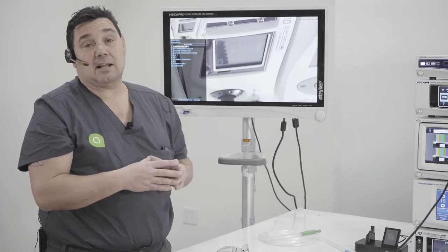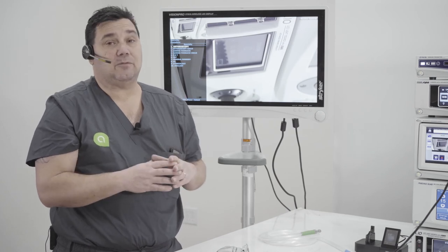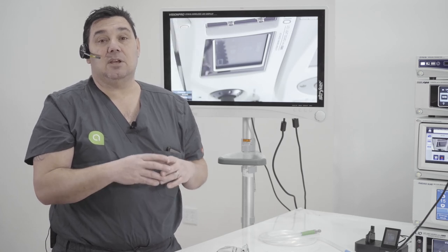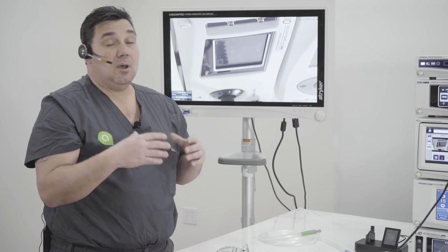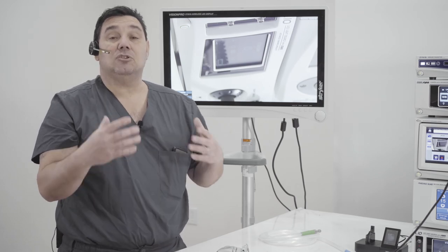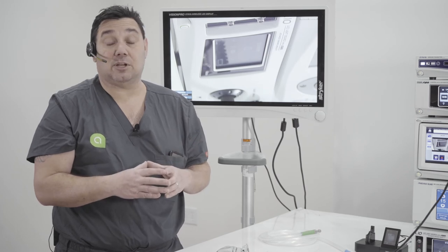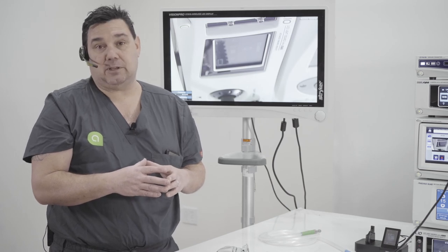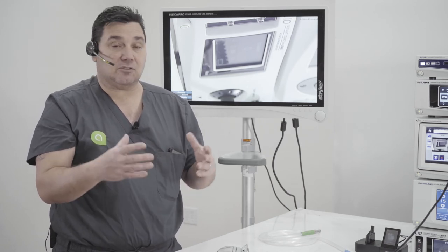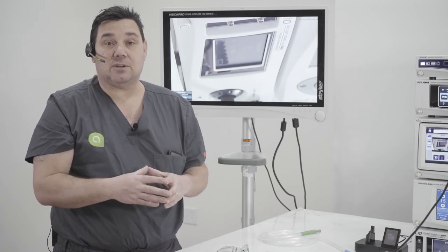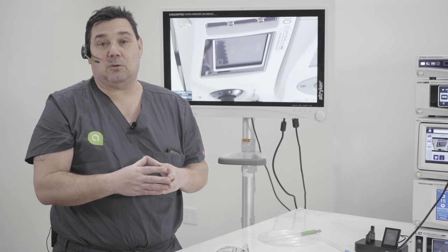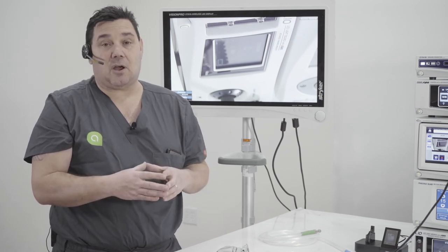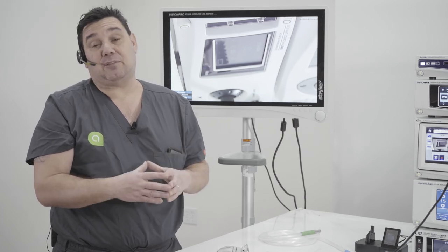Saying 'Capture Image' will capture on channel one. Since the secondary channel is independent, you would need to manually take that image. With the voice control options, the surgeon has more control in the operating room over devices on the non-sterile field — especially useful when the scrub tech is scrubbed in and a single circulator can't stand by the video tower the entire case.